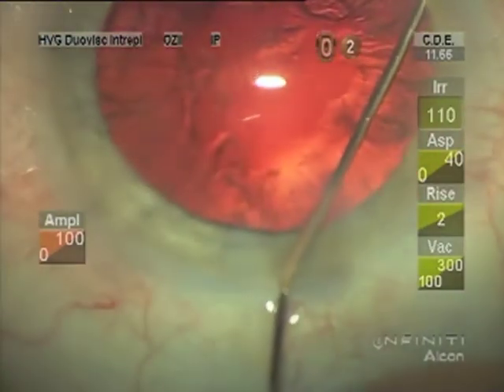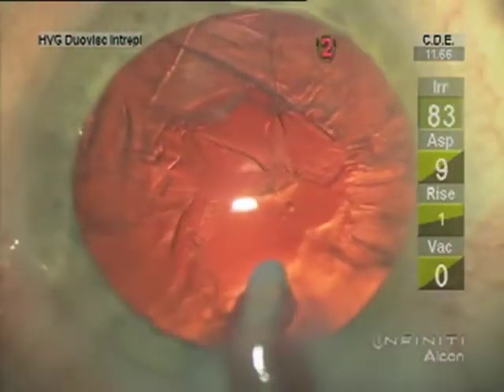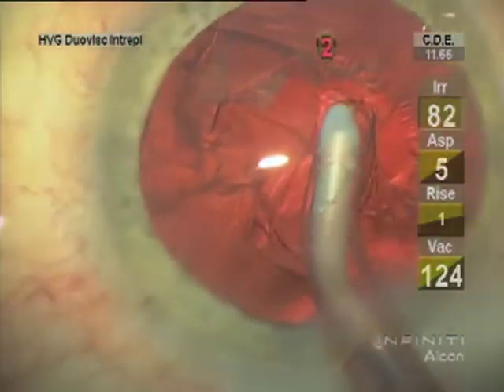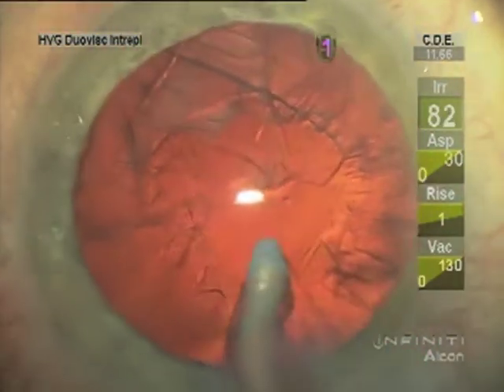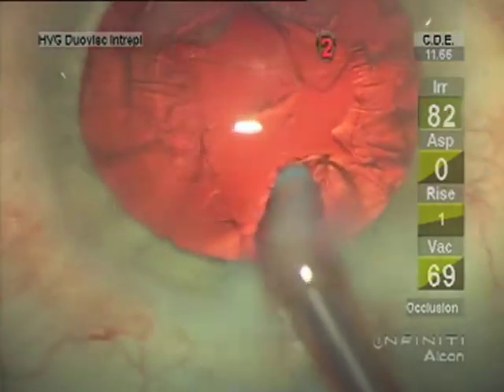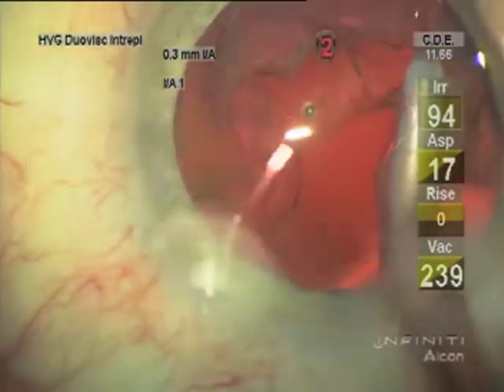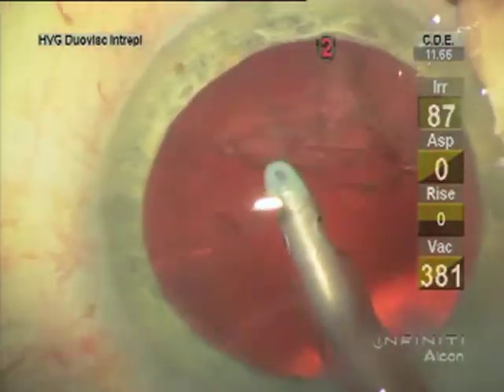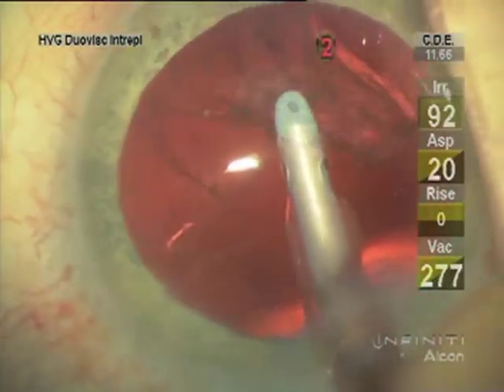While the nurse is changing I put in some more lidocaine and then start the cortex aspiration sub-incisionally, because I'm more certain to get the anterior capsule edge with the initial aspiration instead of at the end where the posterior capsule is already exposed and the posterior cortex might engage the tip for not as clean a dissection. Then I turn the vacuum to the higher limit for this portion of cortex removal, again always trying to start engaging the anterior leaflet of the cortex for much more clean dissection.